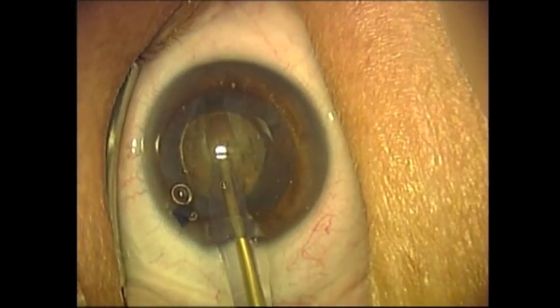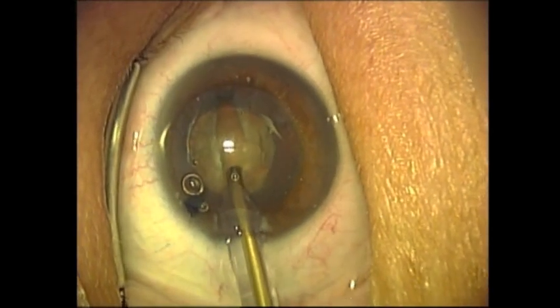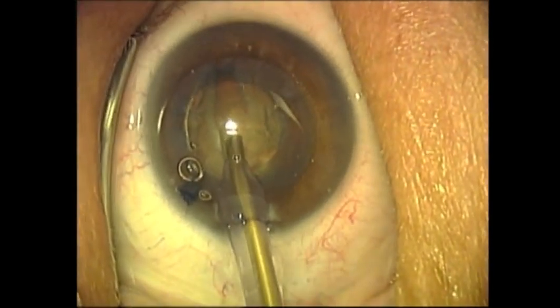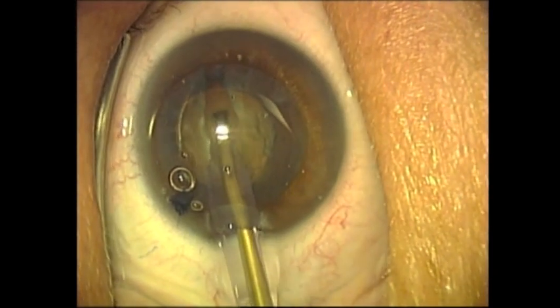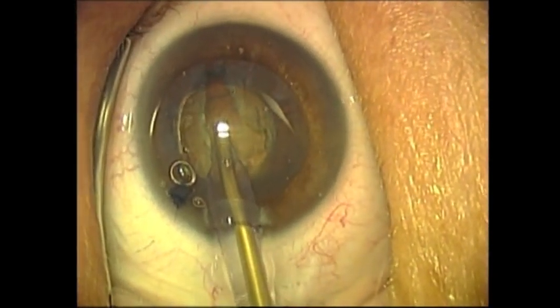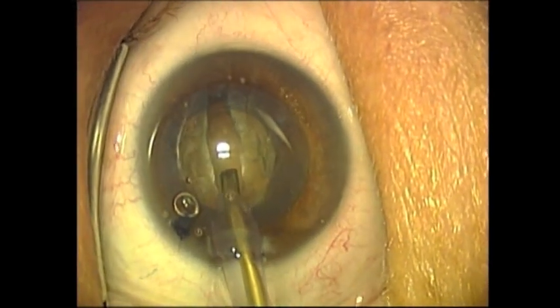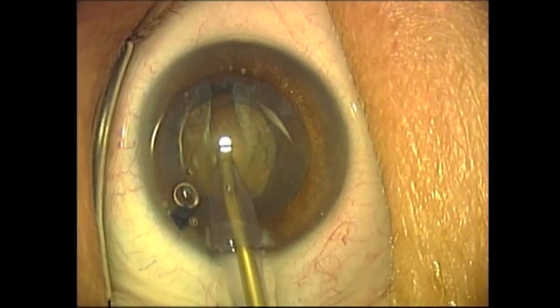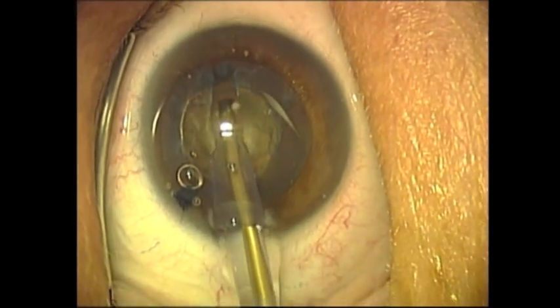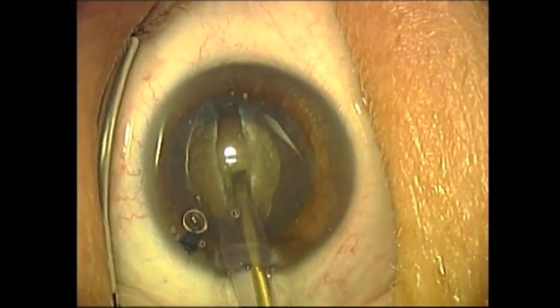The lens emulsifies nicely. This is a Grade III Nucleosclerotic Cataract, which is being phacoemulsified with the Dewey Tip. The initial vertical groove will be made, and then the lens will be rotated 90 degrees. This is the traditional divide and conquer technique.